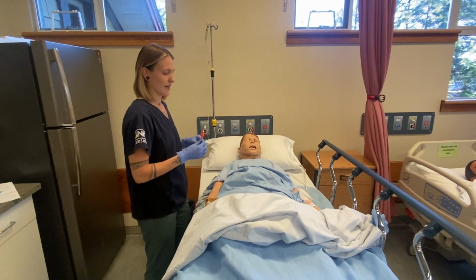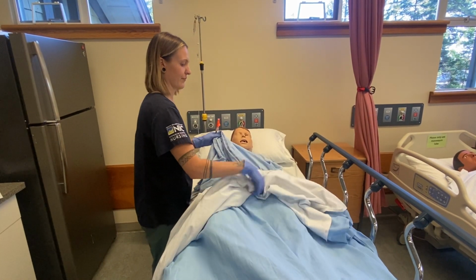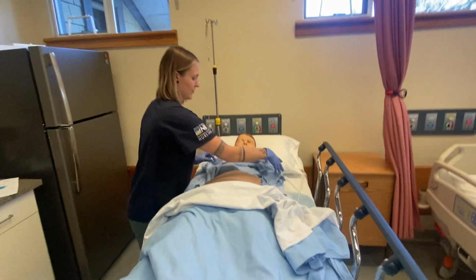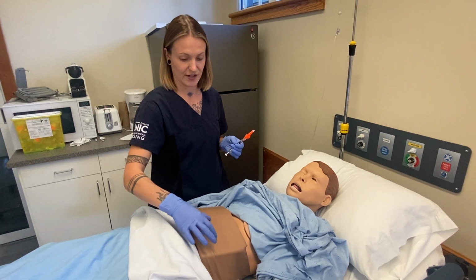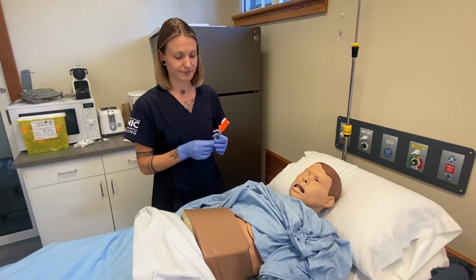You have, okay. So we're gonna do it in your abdomen. Is that where you usually get it? Yep. Yeah, okay. So we'll just lift that, and then to locate it, you want to find the umbilicus, and then 2 inches away in one of the quadrants is where I can give the medication.